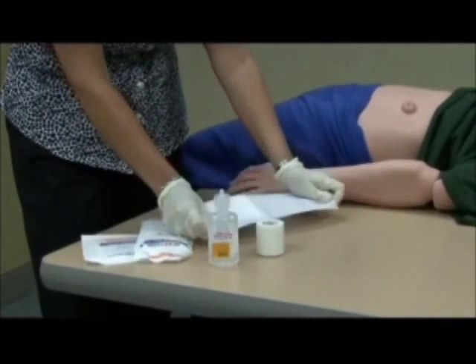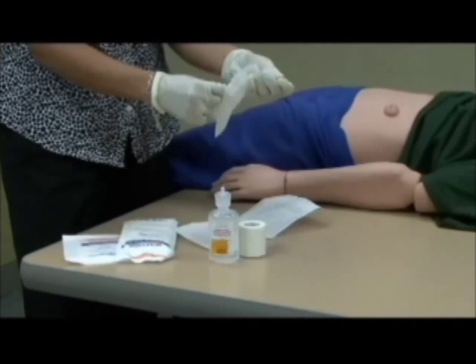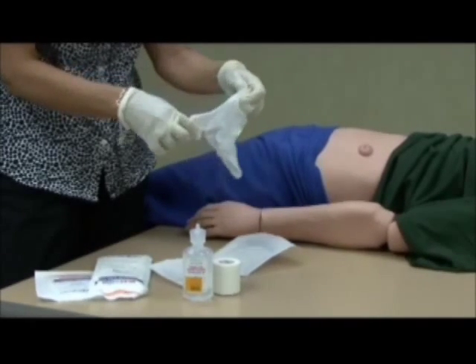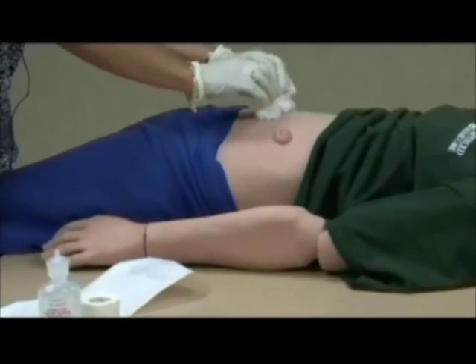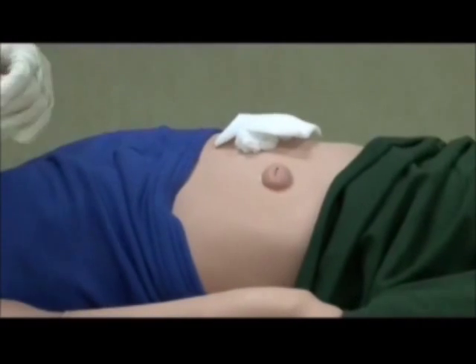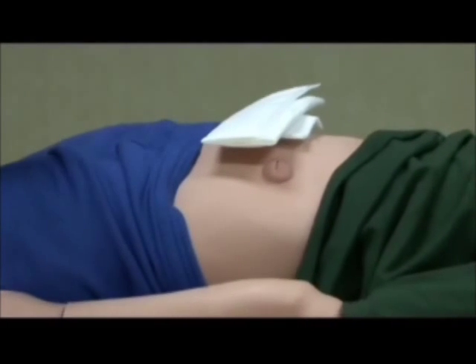First of all, you'll want to open the gauze pad and moisten it with saline. Once you've moistened the gauze with saline, you will then place it inside of the wound. You want to make sure that you completely open the gauze pads in order to provide a fluffed gauze packing. Now you're ready to place your moistened saline gauze into the wound bed, filling it completely. You'll then cover the moistened saline gauze with dry gauze or a gauze pad topper and contact your home health nurse in order to have your negative pressure dressing replaced the next day.